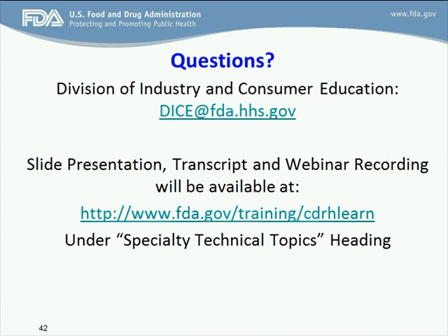Okay, so as you can see in the guidance document, we do not provide recommendations on what specific soil to select. We ask that, whichever soil you select, it needs to mimic the conditions of use of the device or the clinical use conditions of the device.